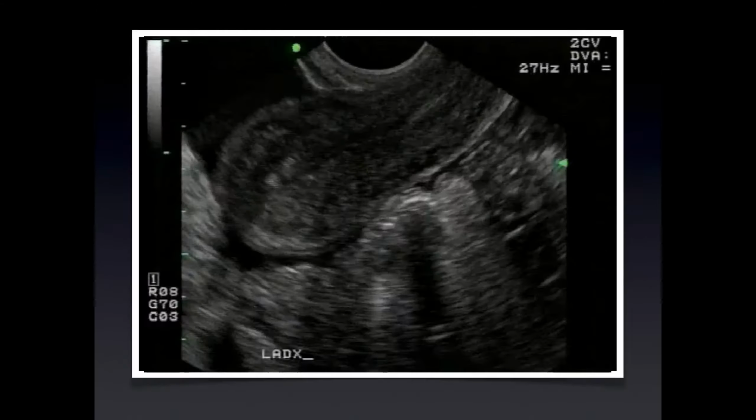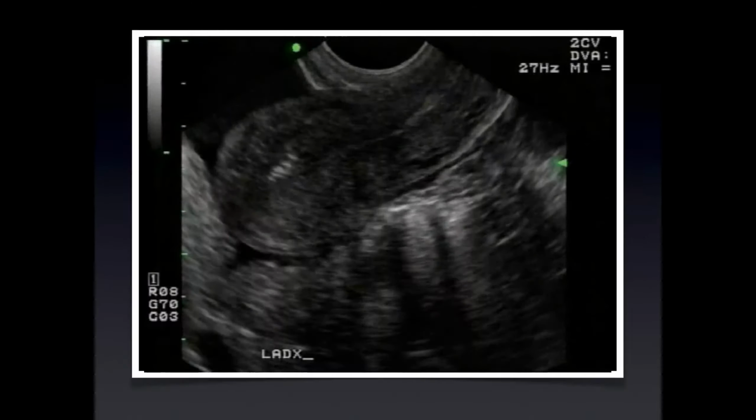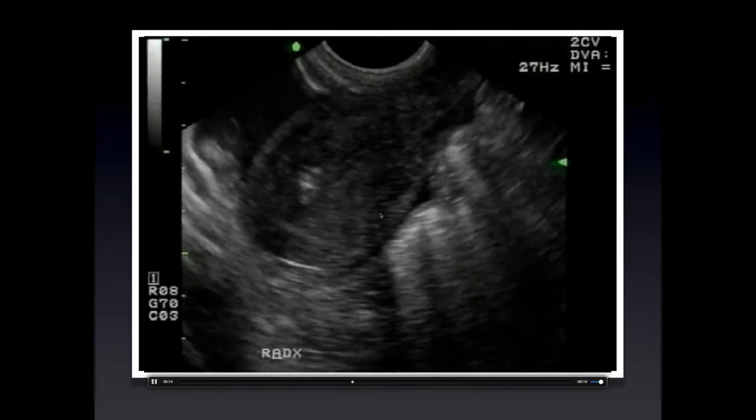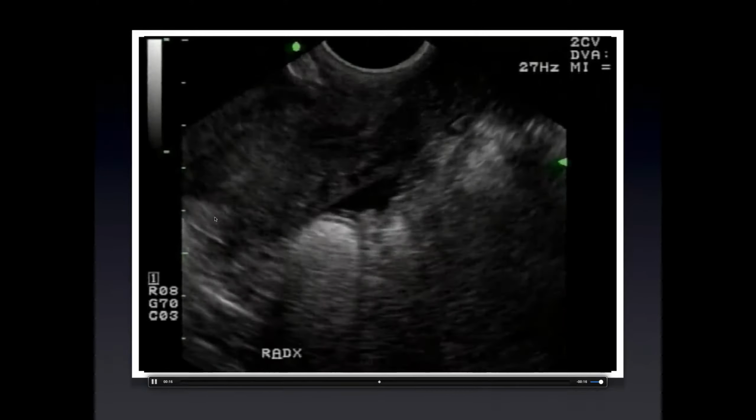Case 7. Again, we're performing an endovaginal ultrasound, and we see the fundus of the uterus here and the cervix here. Small free pelvic fluid would be to about here, moderate to about here. And this pelvic fluid is all the way up to here and even in the anterior cul-de-sac here. So we see a large amount of free pelvic fluid, and when panning out into the adnexa, we see some solid components, some concerning masses. This is a still of the mass we saw there. Again, concerning, but not diagnostic.